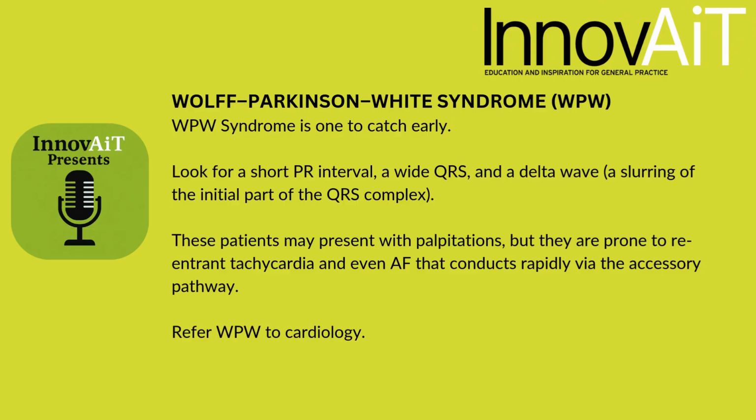Wolff-Parkinson-White syndrome. This is one to catch early. Look for a short PR interval, a wide QRS, and a delta wave, which is slurring of the initial part of QRS complexes.